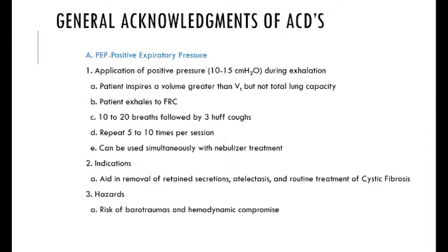You do that 5 to 10 times per session, okay? Do all that about 5 to 10 times and you're done with that patient. It can be used simultaneously with a nebulizer treatment because now we have devices where I can put a breathing treatment in line with that. So you inhale and you exhale through pressure. Not only am I popping the lungs open, but I'm also getting nebulizer treatment every time I inhale.